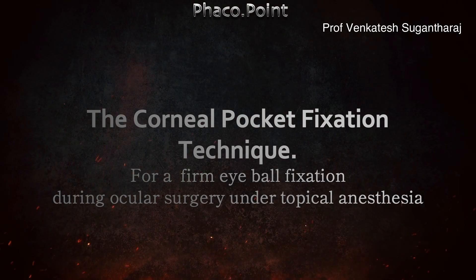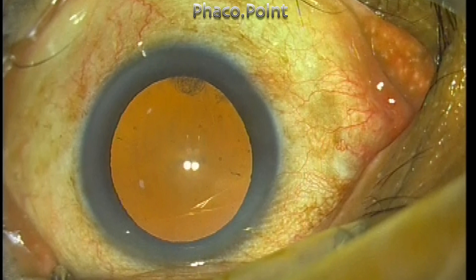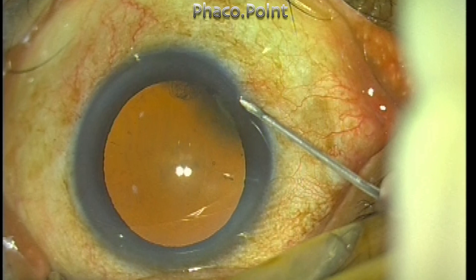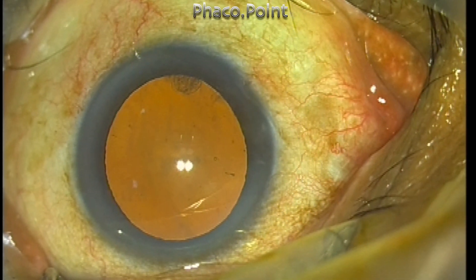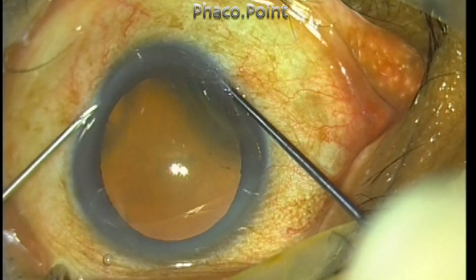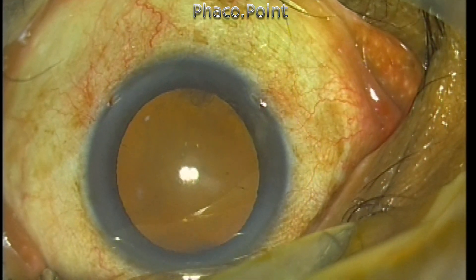Hello friends, today I'd like to describe the corneal pocket fixation technique for getting a firm fixation of the eyeball. First, you have to create a small blind pocket into the clear cornea without entering the anterior chamber — this is a partial thickness pocket. Using a rod-like device passed through the pocket in a tangential fashion, you can get good fixation of the eyeball.